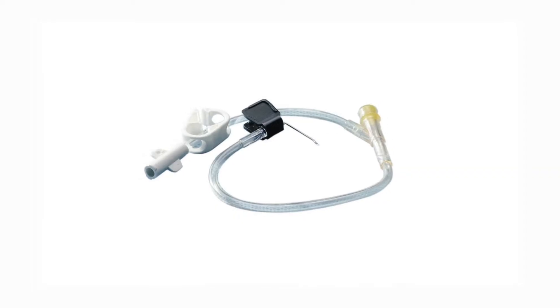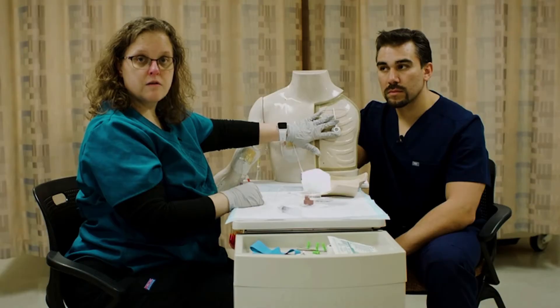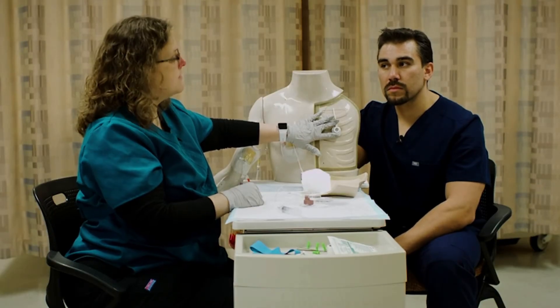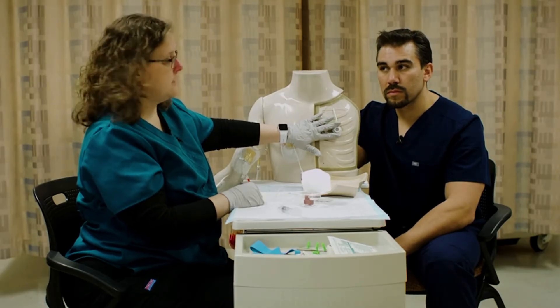Now we're not going to go through sterile technique and all of those things. We've done that in other videos, and you'll learn that for real when you actually have to do this. However, we're going to go through what it actually looks like to access it.